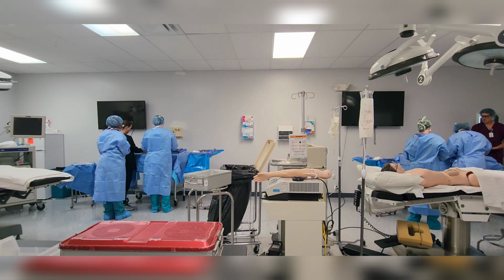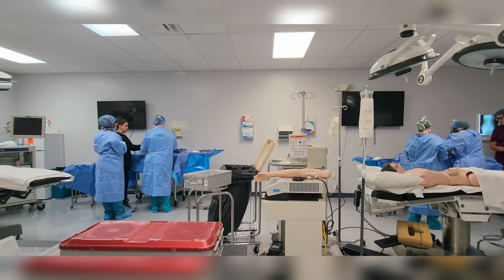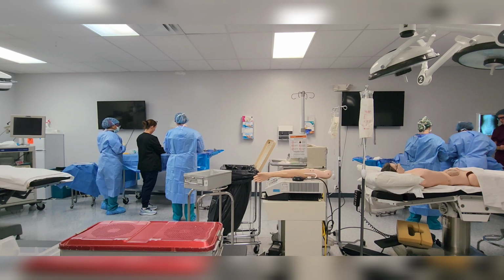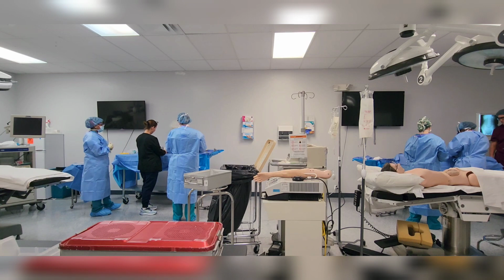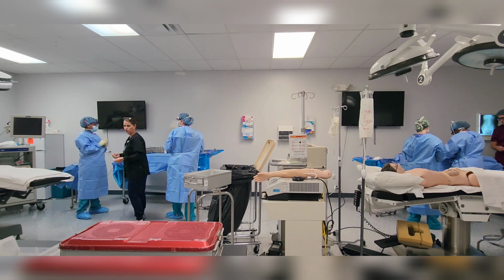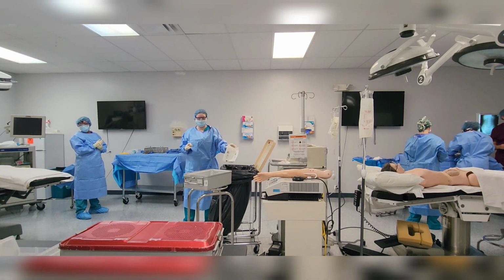Okay, are these supposed to go under the towel? No, it's not. Here, I'll show you. You're going to open it. Oh, these aren't towels. This is actually a suture. Oh, I thought it was the ties. Nope, that's actually a suture, but we'll get you some ties. Don't be shy. Just keep going. Keep moving. Here we go, through the process.